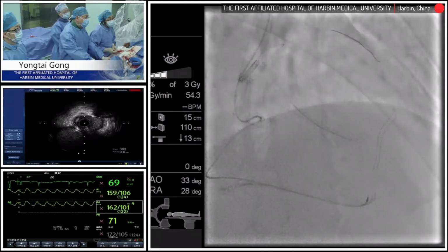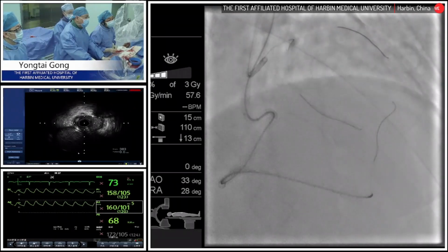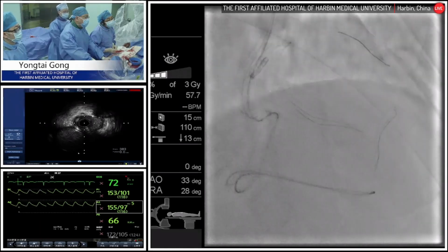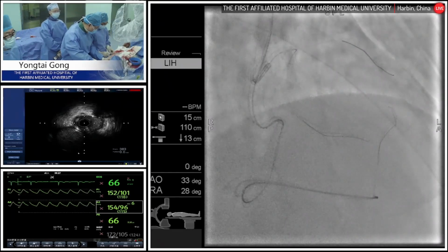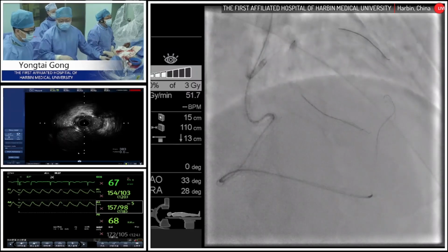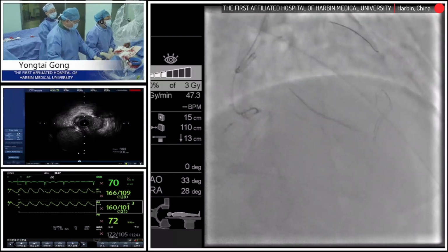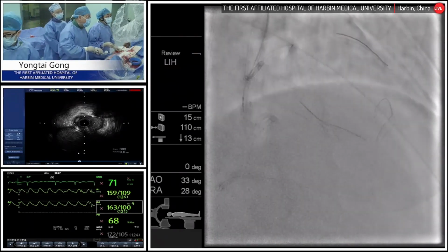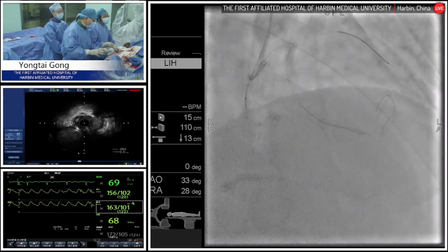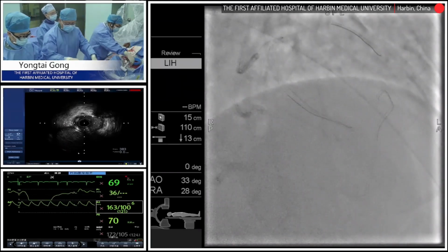And also, I want to mention that for the retrograde microcatheter, we have several choices during clinical usage. The Corsair microcatheter we just mentioned is a very popular microcatheter, no matter whether antegrade or retrograde. We can use it, advancing with rotation, and improve its crossability significantly. Rapid clockwise and counterclockwise rotation of the microcatheter with both hands, with no more than 10 turns in one direction before releasing, is a trick of this microcatheter.